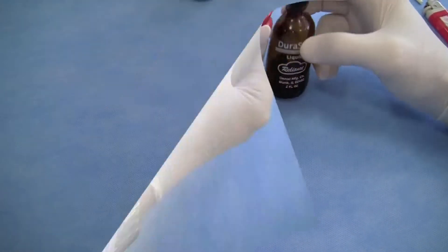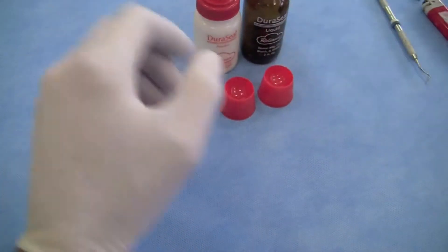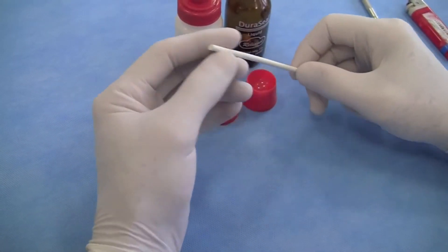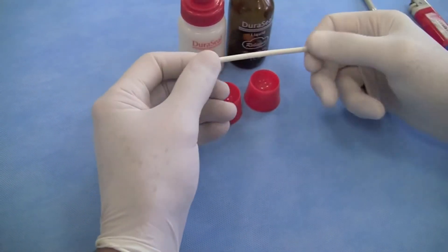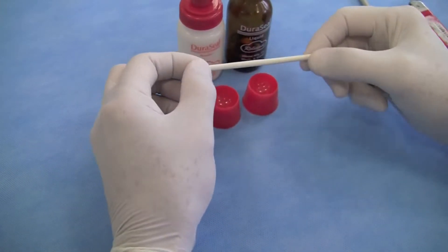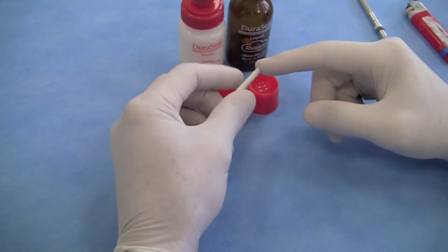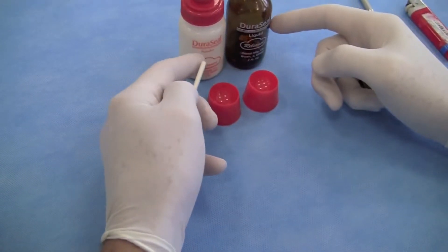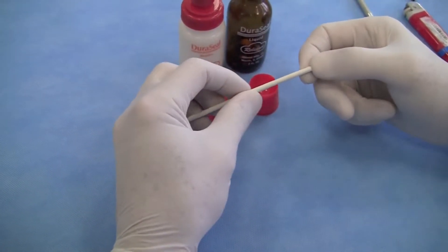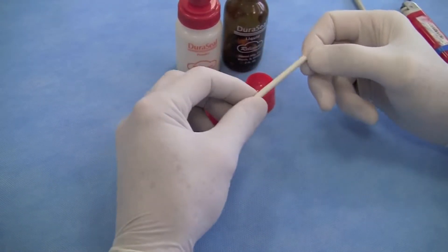We'll also need some disposable or glass dappen dishes. This is Gutta Percha made by the Hygenic Company — a dental stopping material. We're going to take a small piece, heat it up, and use it at the gingival increment. The reason for using it gingivally is to protect the gingiva from the acrylic, which is somewhat toxic to the tissue. This will keep the tissue very healthy, and when we go to deliver the restorations, the tissue will be in a much better state.